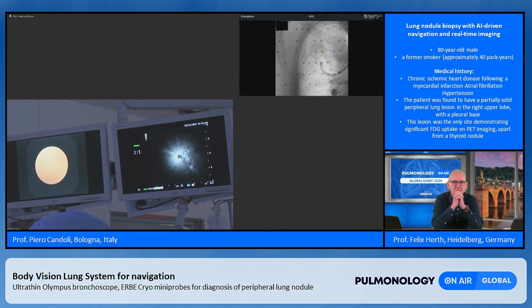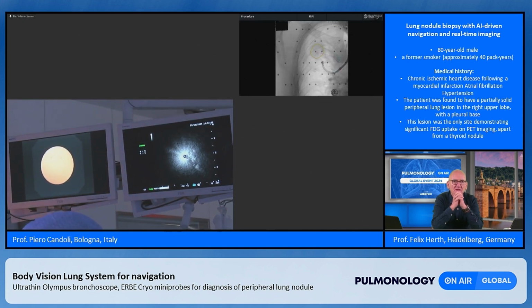The question is whether LungVision can work with GE, with Siemens, with Fuji, whatever, or is a dedicated arm needed? I think that it is ready for every platform of fluoroscopy, with every fluoroscope. There is no limitation.